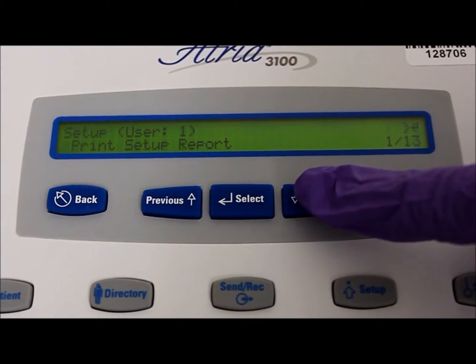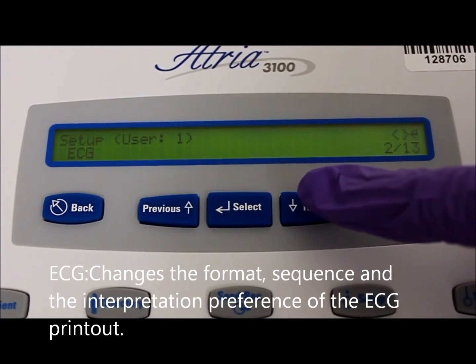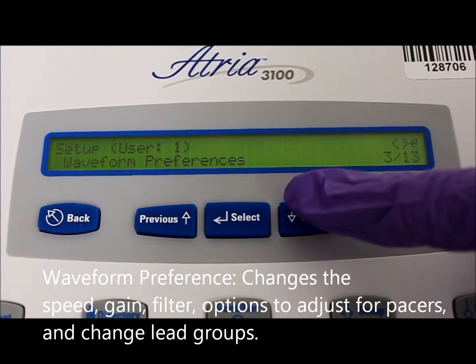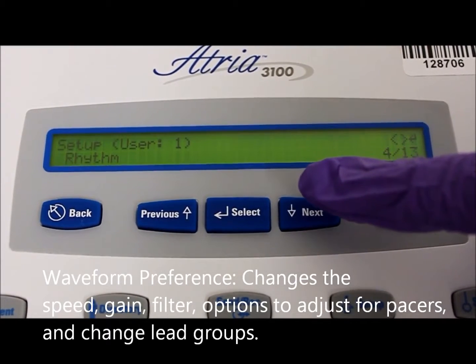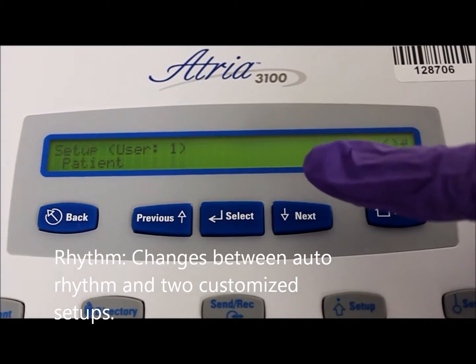ECG is an option where you can change the format, sequence, and interpretation preferences. Waveform preferences: you can change the speed, gain, baseline filter, pacer enhancement, lead group. Rhythm: this option allows you to choose between auto rhythm and 2 custom rhythms.